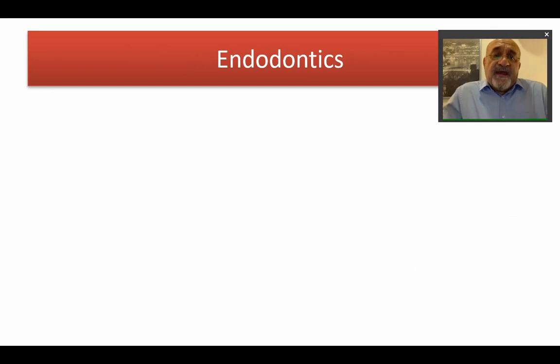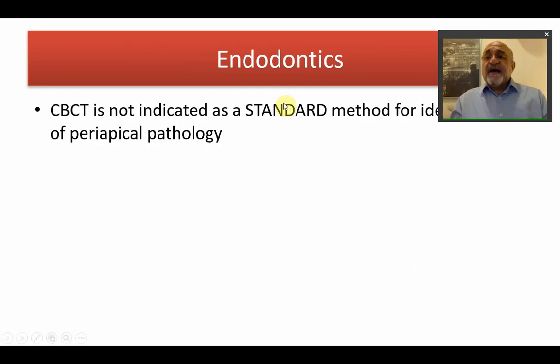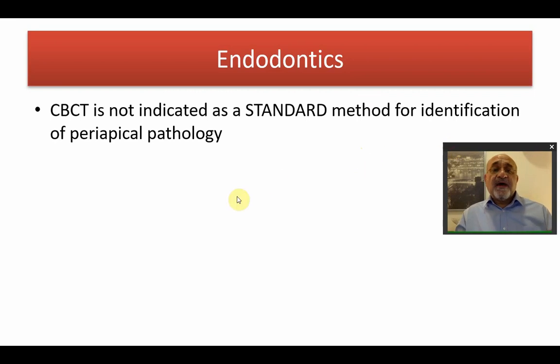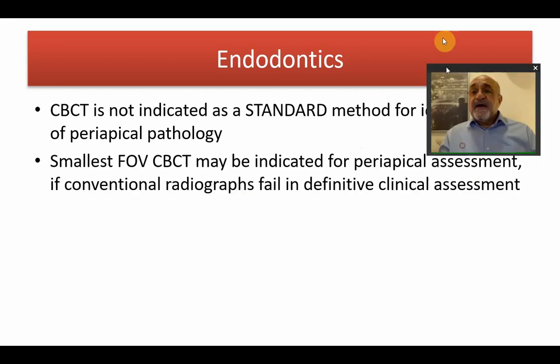Endodontics. In endodontics, again, CBCT is not the standard method of identification of periapical pathology.